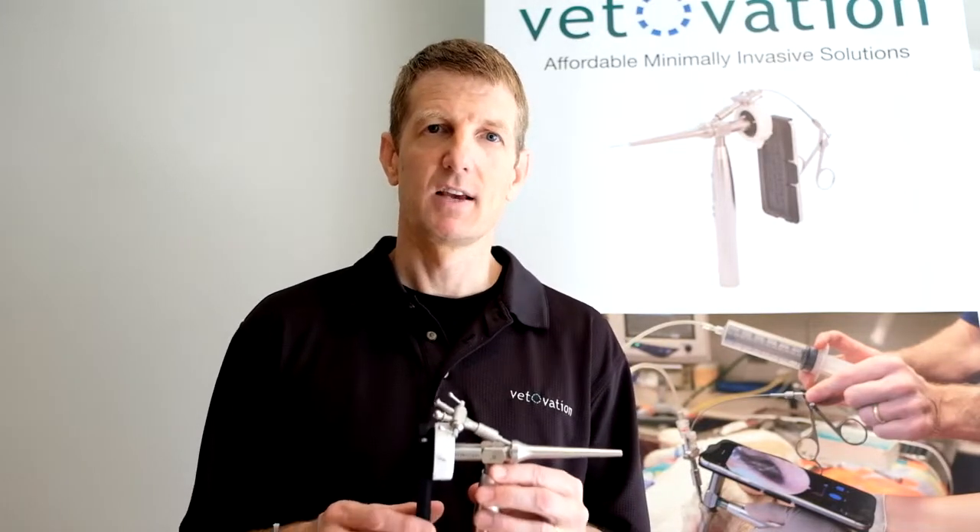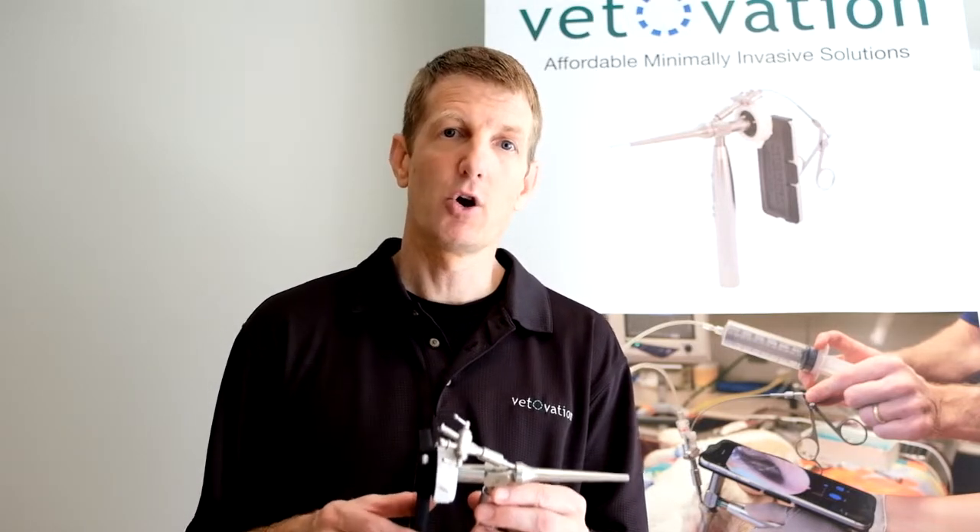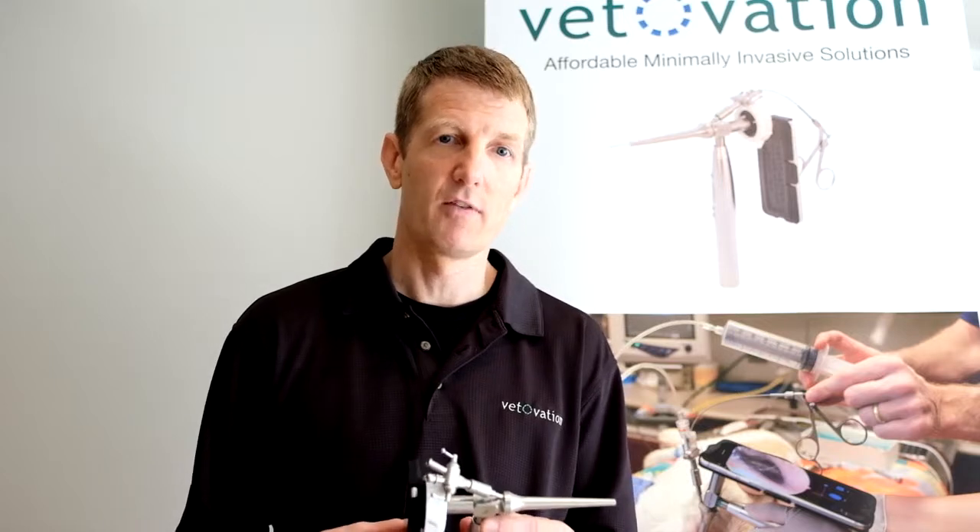Hi, I'm Les Meadowcroft with VetOvation. Thank you for investing in the SmartScope system that enables you to better examine an ear, nose, or other areas of your pets.